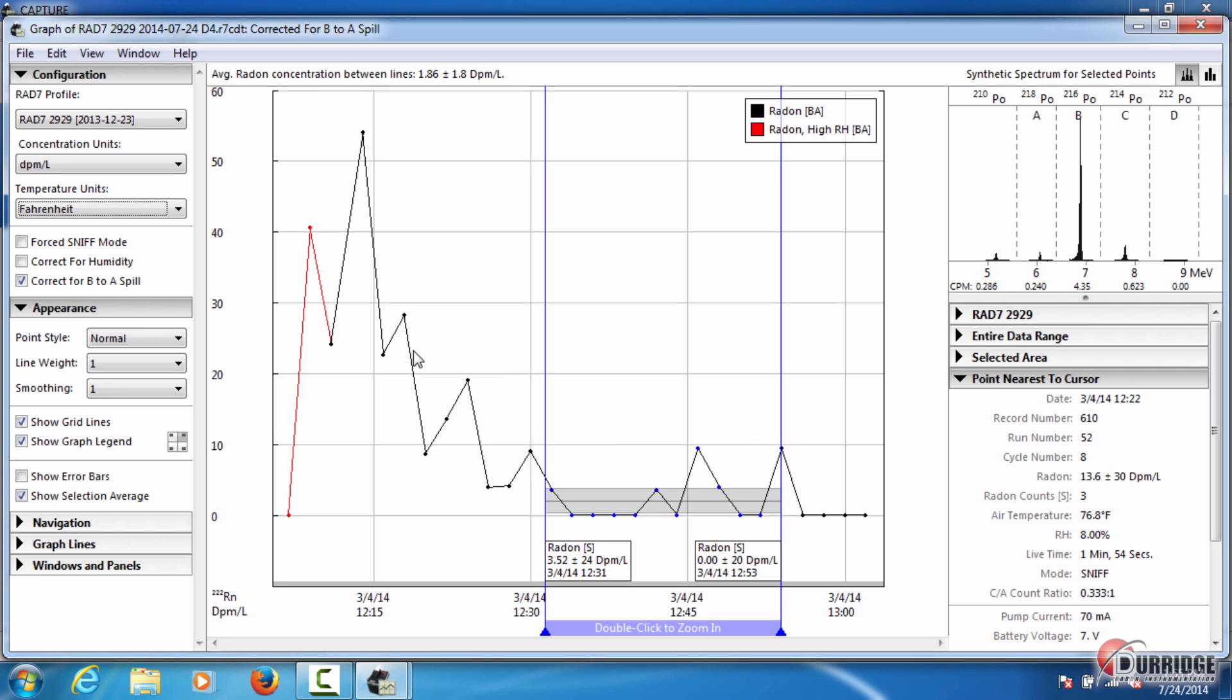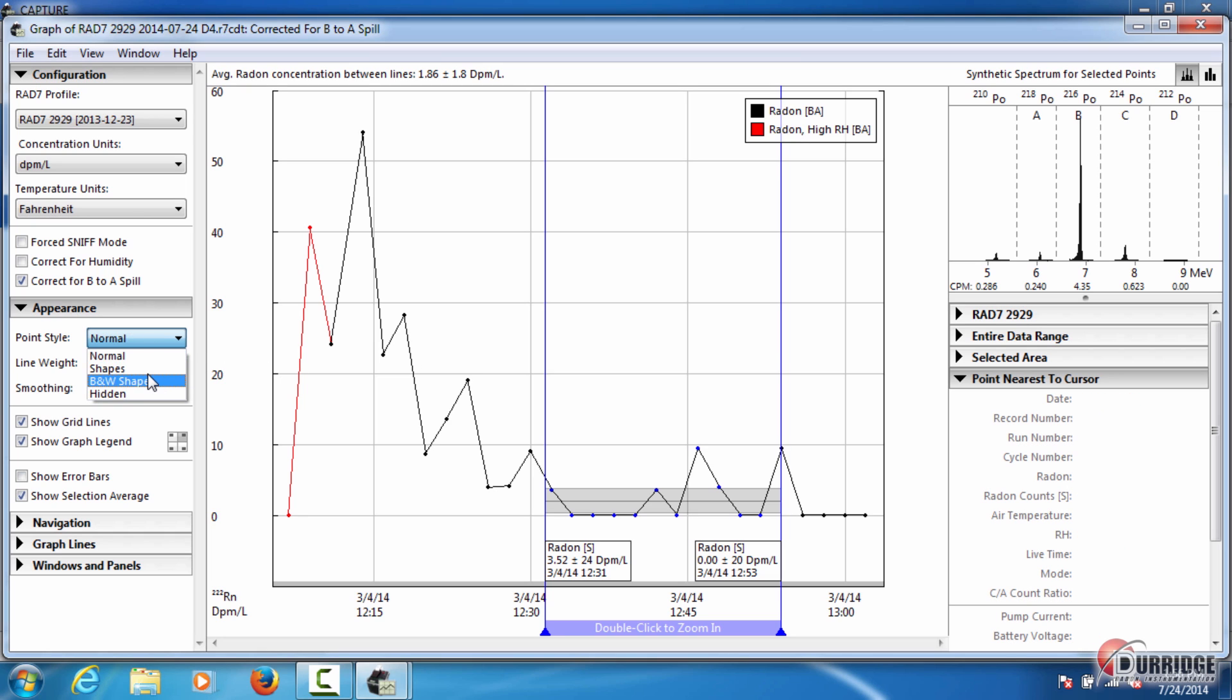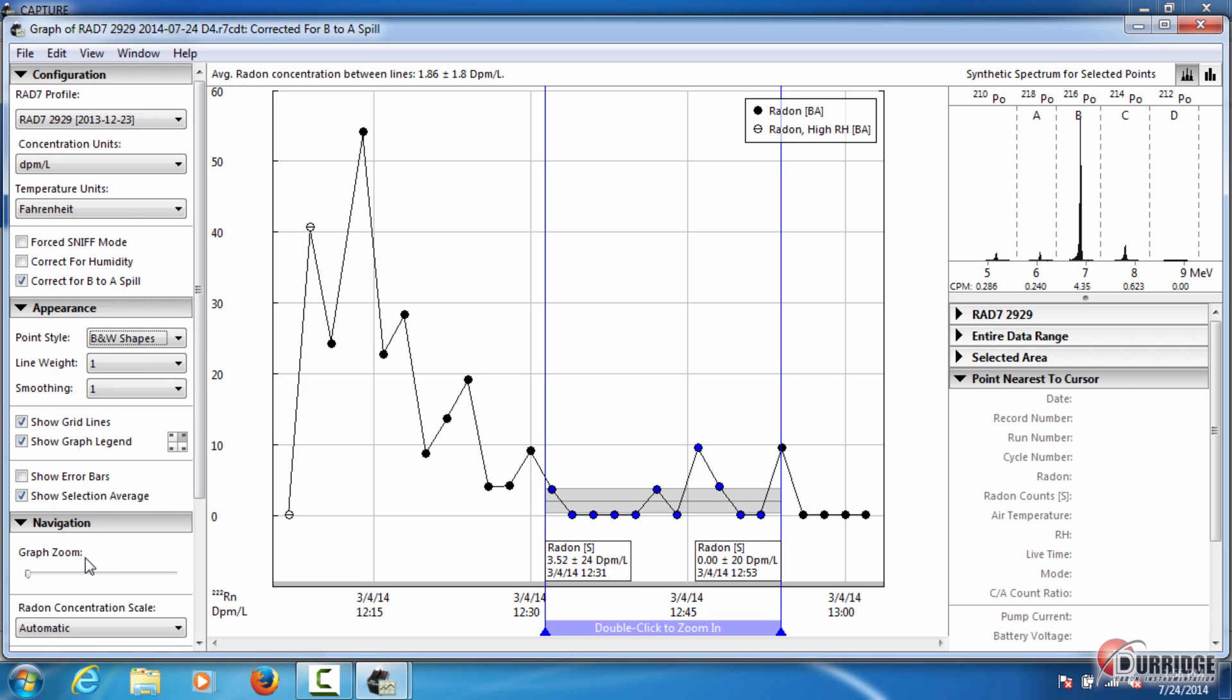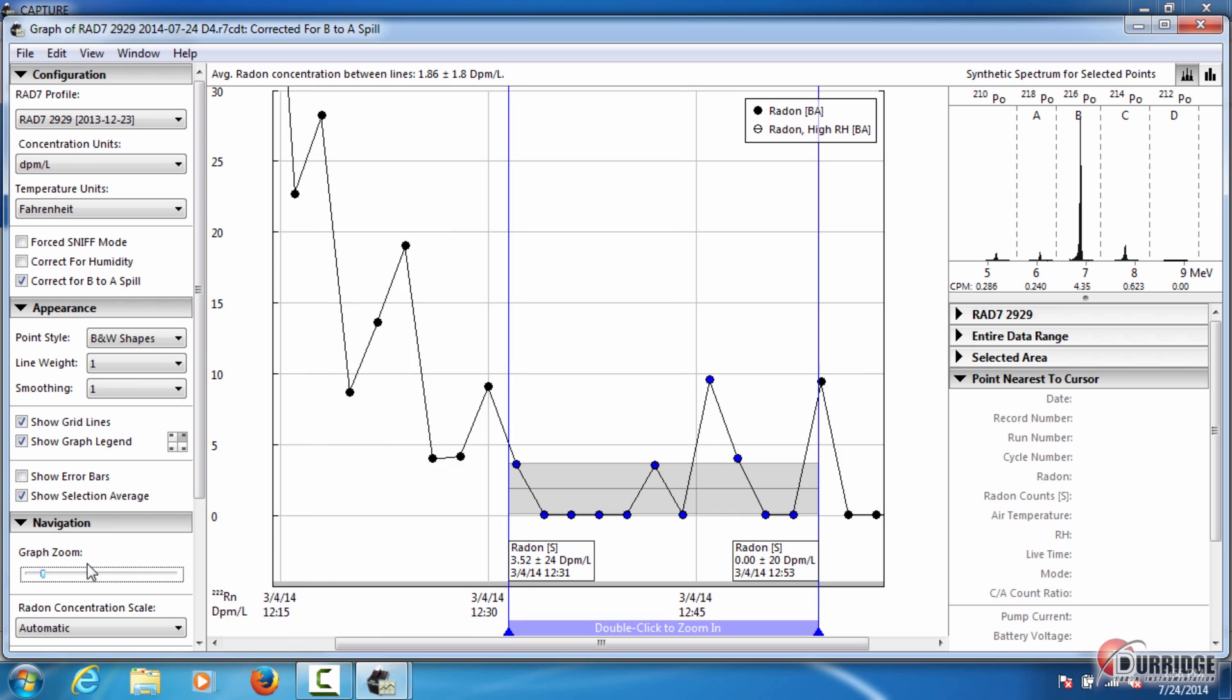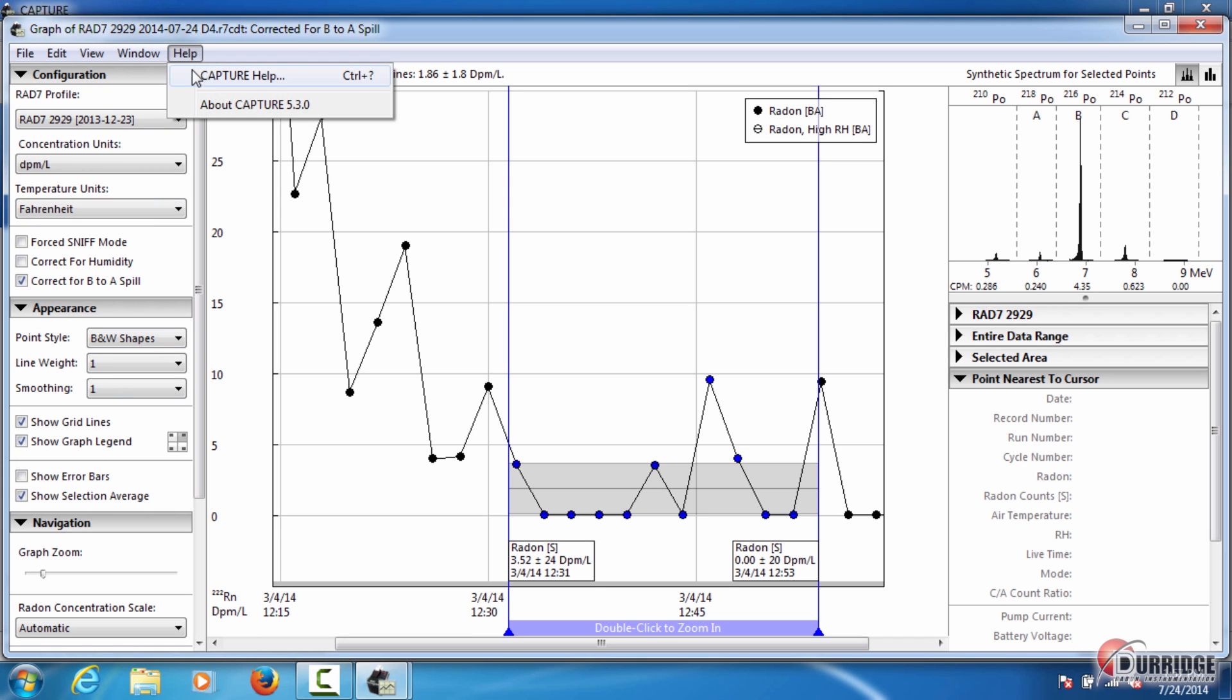Those are the basic methods for viewing Radon data. You can also configure the graph using the appearance panel and other panels located to the left of the graph. To read more details on the controls available in all panels, please see the capture manual, which is available by clicking Help, Capture Help.